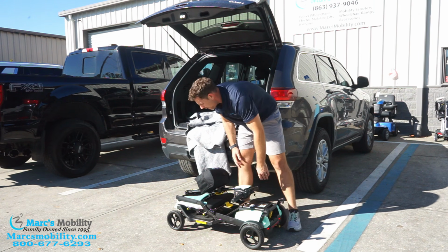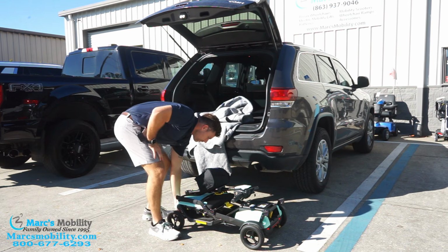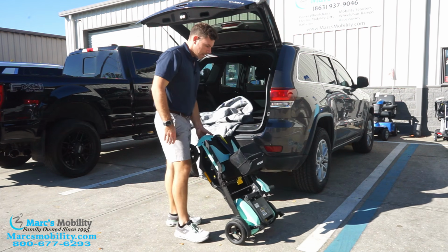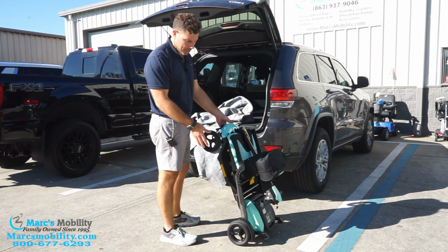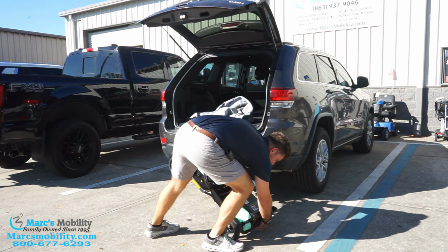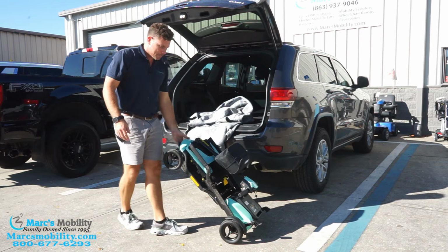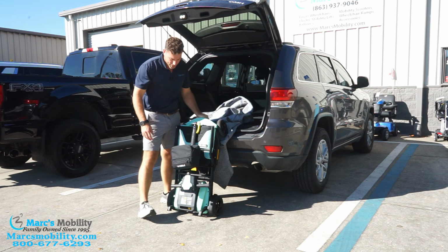Now from here, the next thing that you're going to want to do is stand this unit up. So you're going to go from the front. There is a nice handle here from the front that you can grab this with. Now for these purposes, currently on this chair, there is no anti-tip wheels. So what they do recommend is if you don't have this in freewheel, go ahead and put this in freewheel. There's a yellow lever right here in the back. If your chair's on, you're going to hear it beep, but now you can actually freely roll this around and stand this on the back of your vehicle.